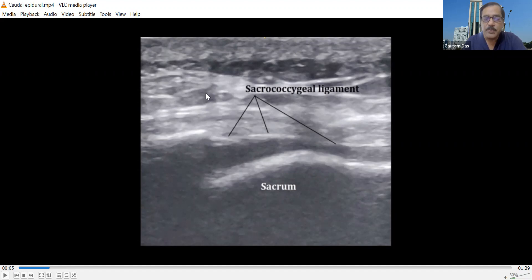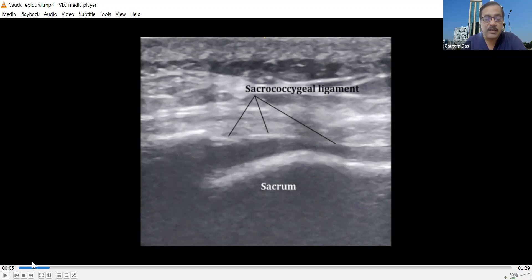Because it is a bony structure, the ultrasound beam cannot go past it, and we are getting an acoustic shadow. But the ultrasound beam can pass through the sacrococcygeal ligament, and that's why we can see this part of the sacral canal.